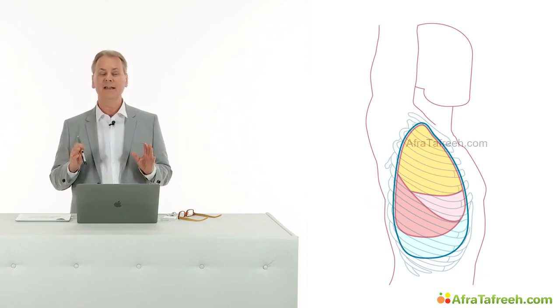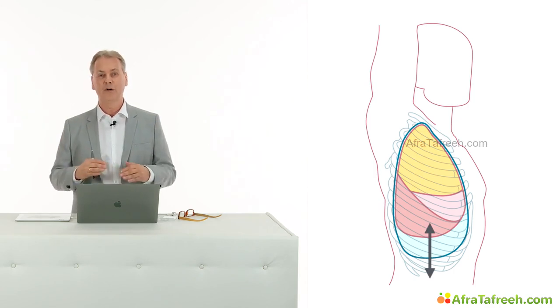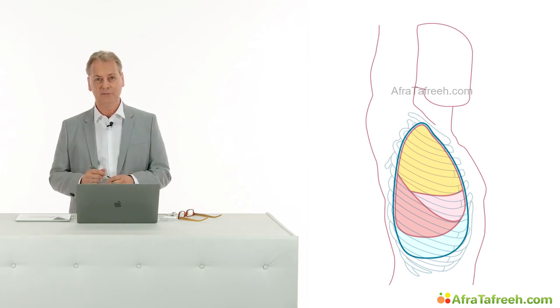Observe especially the basal parts of the lung, so the motion of the diaphragm. This is where you most frequently will find pleural effusions.